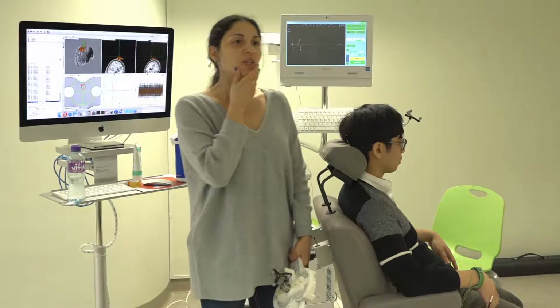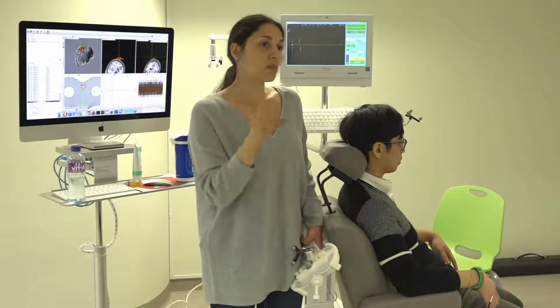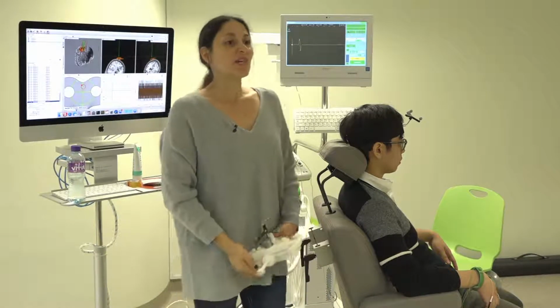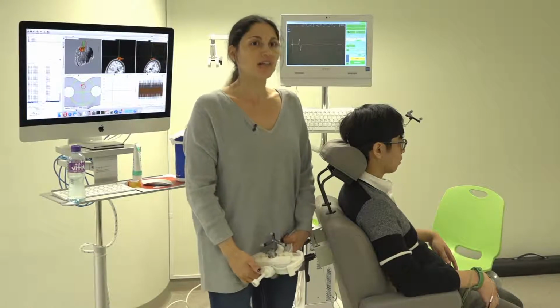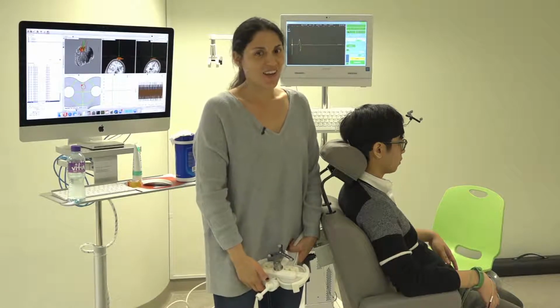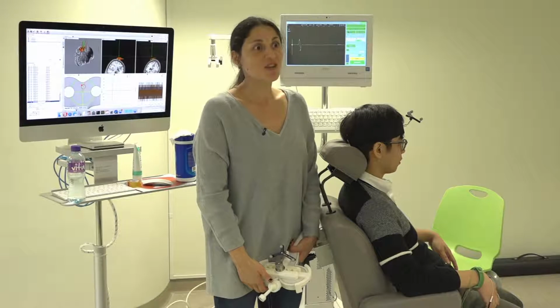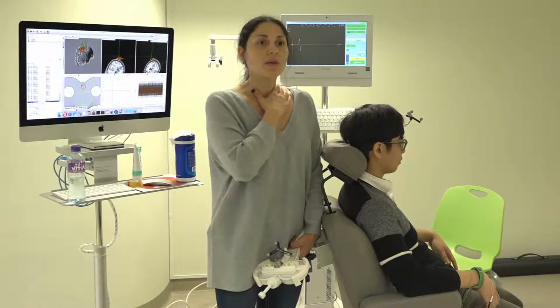I had an experience with one subject who realized he could do it. I had to discard him from the study because he said, you know, I'm manipulating the things. I think high and it goes high. I think low and it goes low. And he's like, do you want to see? I'm like, okay, I don't want to see, but thank you for letting me know. So you can really manipulate that.